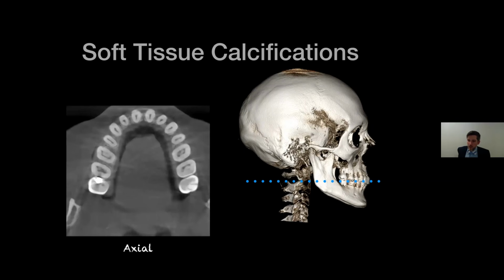Someone asked, who should make the radiology reading or interpretation, the dentist or the oral maxillofacial or medical radiologist? That's the beauty of dental. You are the CEO, you are the practitioner, you call the shots. It's like it's your own hospital. So if you were to do the acquisition interpretation code, you could read it yourself.